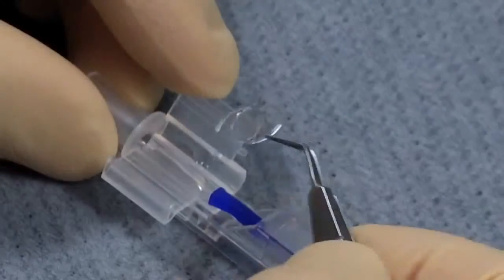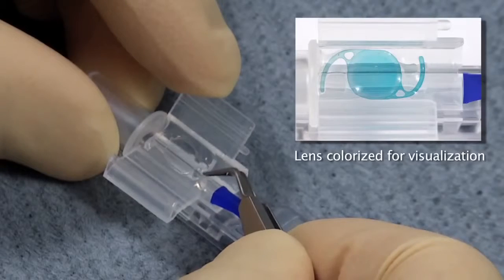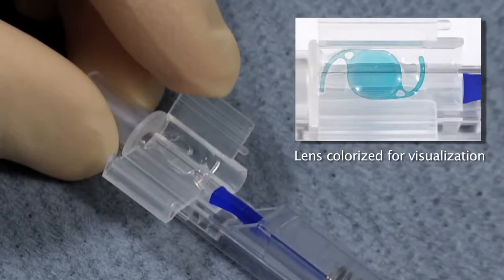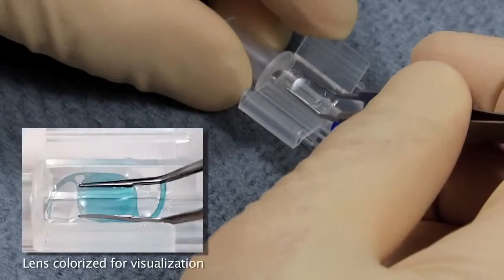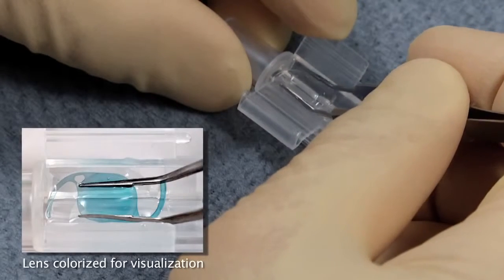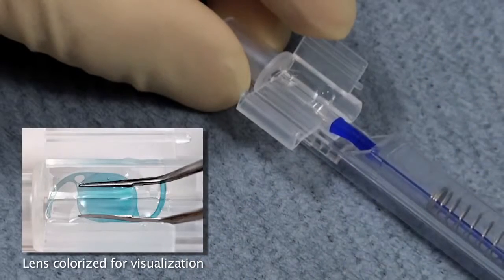Position the lens in the middle of the loading chamber so that the anterior side is up and the lens is in a reverse S orientation. Apply slight downward pressure with the forceps to push the lens and haptics down and ensure they are properly seated under the grooves.